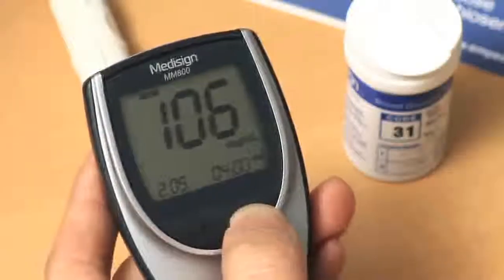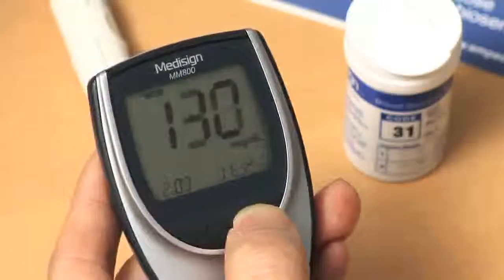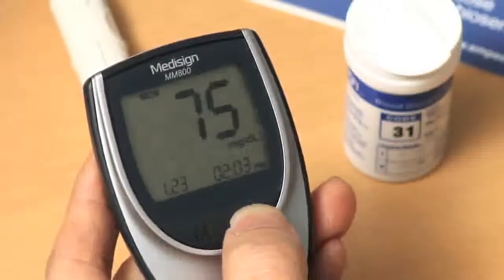Each time you press the C button, the screen will show the previous test result, as well as the date and time it took place.